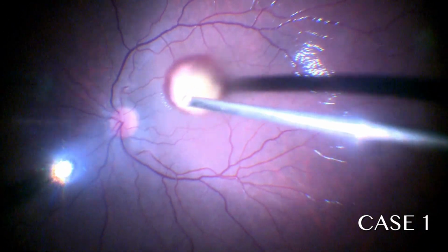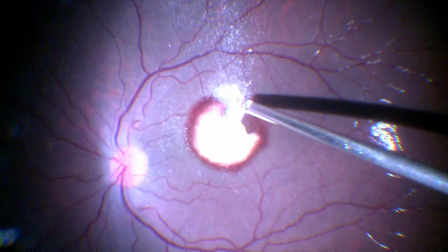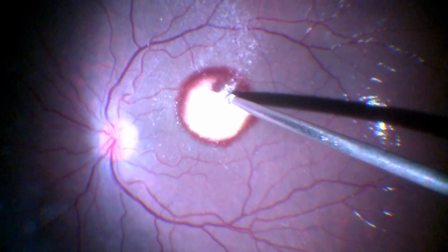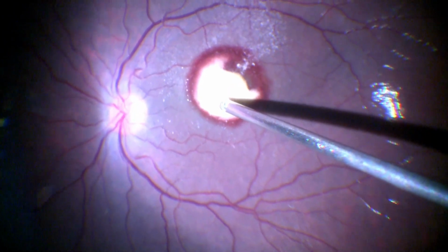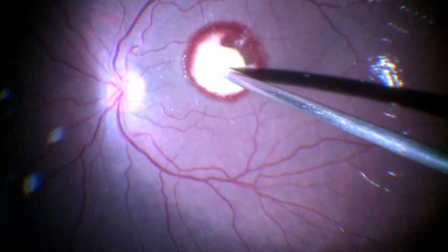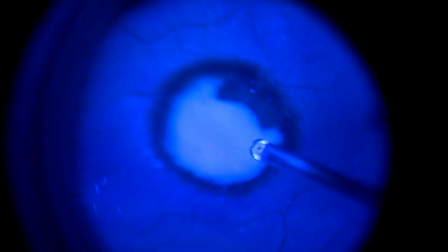This is a case of non-resolving pre-retinal hemorrhage with dehemoglobinized blood. Core vitrectomy was followed by IVT-assisted PVD induction. Inability to aspirate the hemorrhage with the cutter suggested the sub-ILM nature of the bleed. Brilliant blue dye was used to stain the internal limiting membrane.